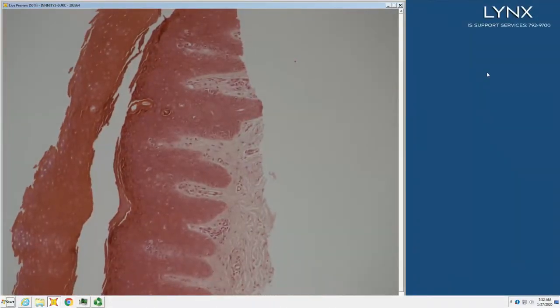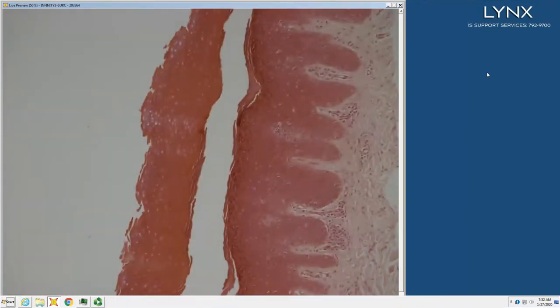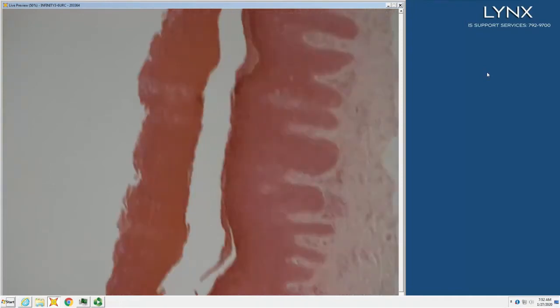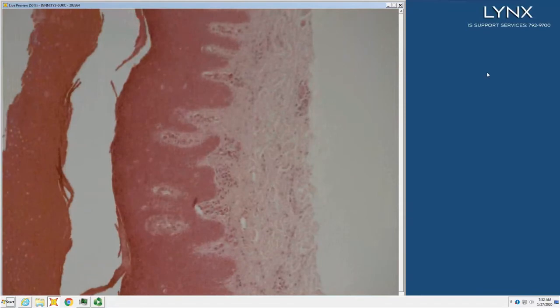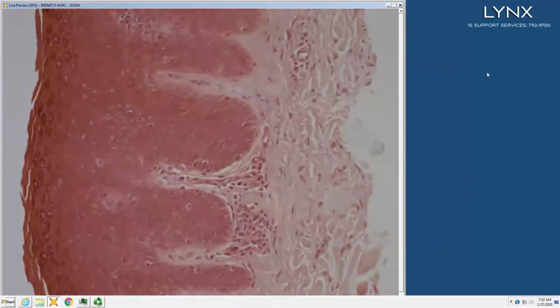So, acral skin. So you see some hypergranulosis. I don't see particularly blue cells. Now the stain's a little on the eosin heavy side, but I don't see foamy blue cells like EDV. I do see significant hyperkeratosis, right? And the other thing that I see, although they're not many in number, what do you think about the size of the lymphocytes?